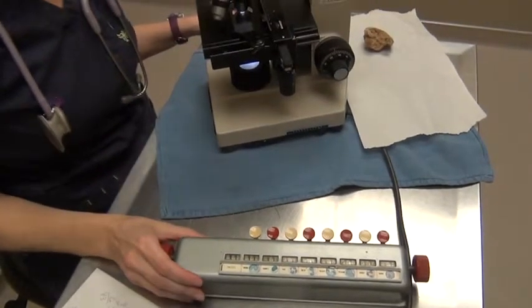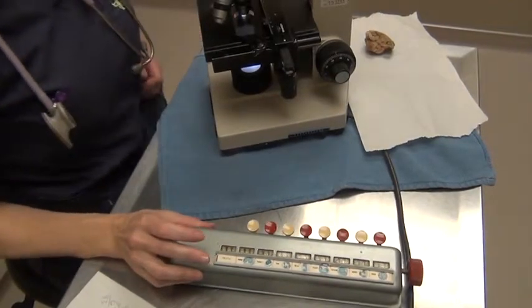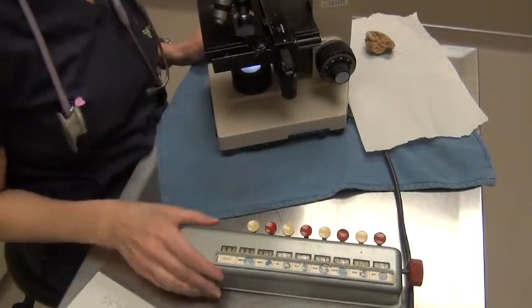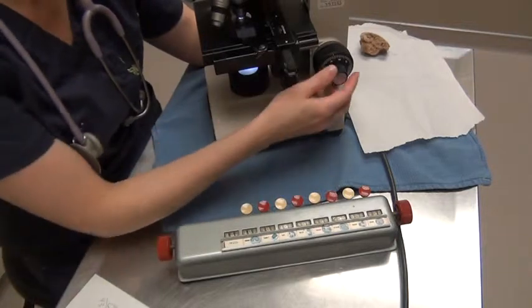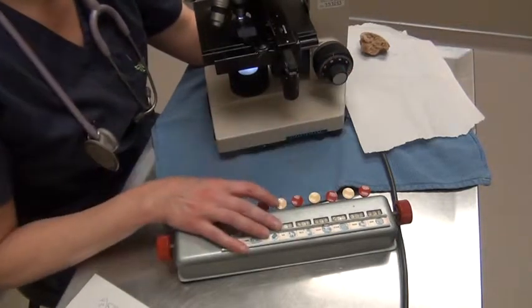Okay, now it's time to go ahead and use our differential blood cell counter to perform the white cell count. I'm going to be sweeping the whole slide until I count 100 cells. That will take some time. Okay, so I've continued counting and my cell count is almost 100.